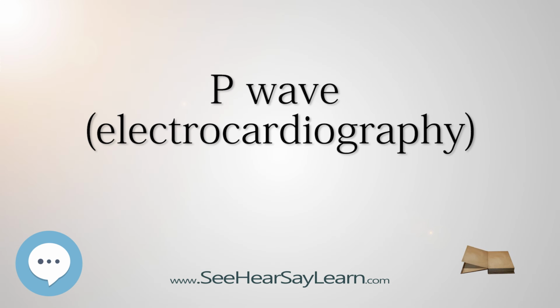The clinical relevance of this is that, although a normal phenomenon, the nadir of the TA wave can occur just after the QRS complex and cause ST depression similar to, and easily mistaken with, that occurring with disease states such as cardiac ischemia.